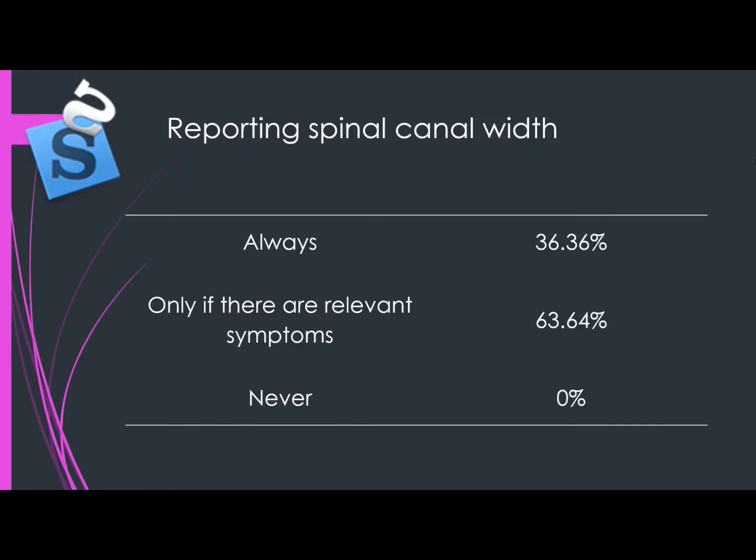The spinal canal width is a very sensitive topic because usually when there is no compression and when it is not narrowed, the radiologist doesn't have time to report it, even though we would like to report it more often. That, however, could be made easier with automation, but given our current workload, it is in most cases not really feasible.